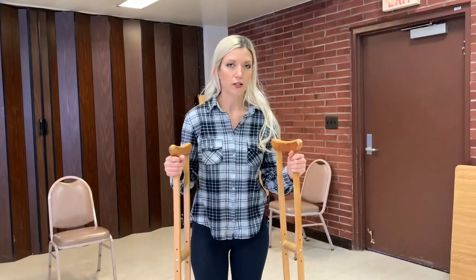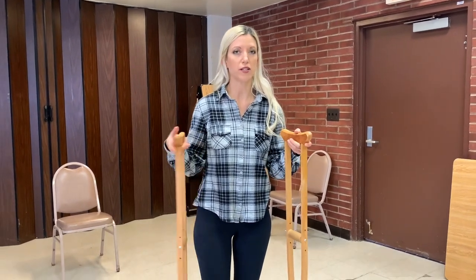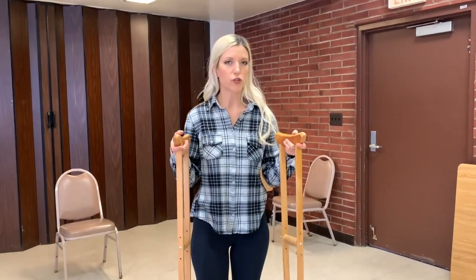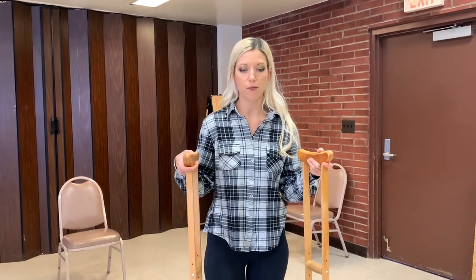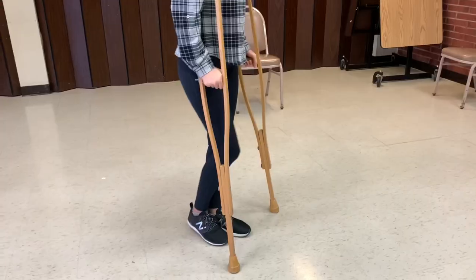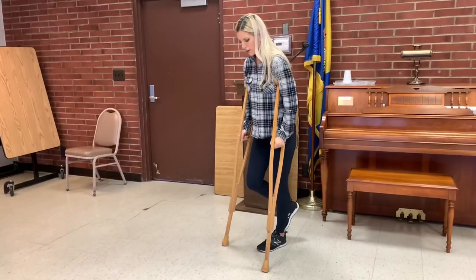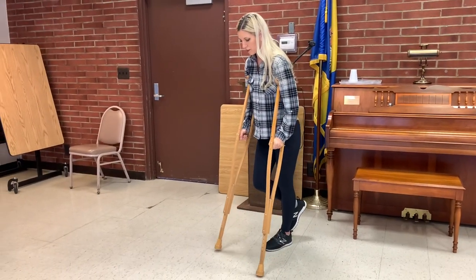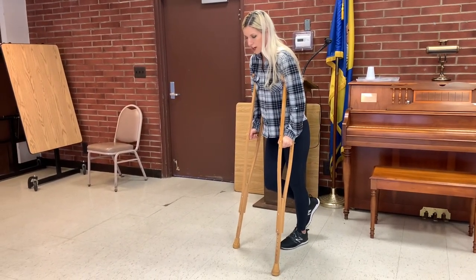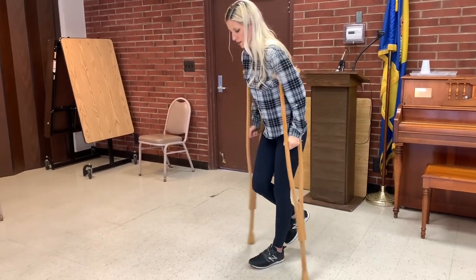So crutches are typically used when your doctor or healthcare provider wants you to be non-weight bearing on a leg that has had a recent injury or a surgery. And gradually while you're using crutches, you will become more weight bearing on the affected leg. So let's just say my right leg is the injured leg. You're gonna start non-weight bearing on that leg. So you're going to put all the weight in your hands. You're going to move the crutches ahead about a foot, lean forward slightly, and swing the good leg through.